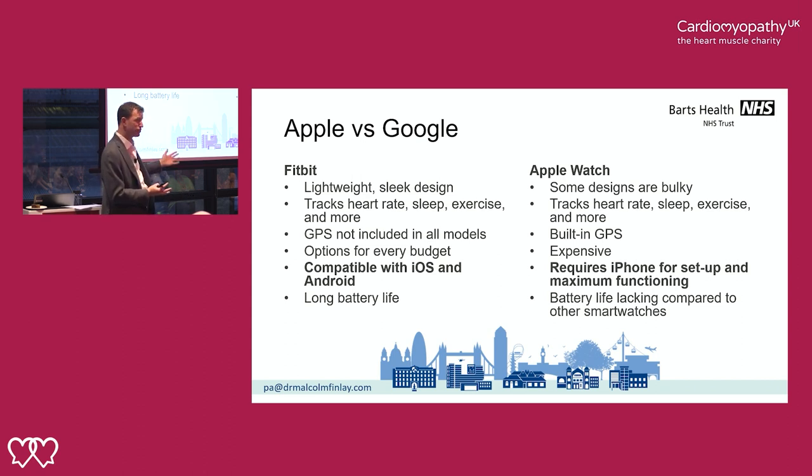The Apple Watch battery needs a charge every night. Some of the other ones will work all week. That's important to some people. But what I'm not mentioning here is which one's better at health tracking, because they're all absolutely great. The best, cheapest one that's worthwhile seems to be one of the latest bottom of the range Fitbits with ECG. It changes, it's like series number 6 in their catalog.